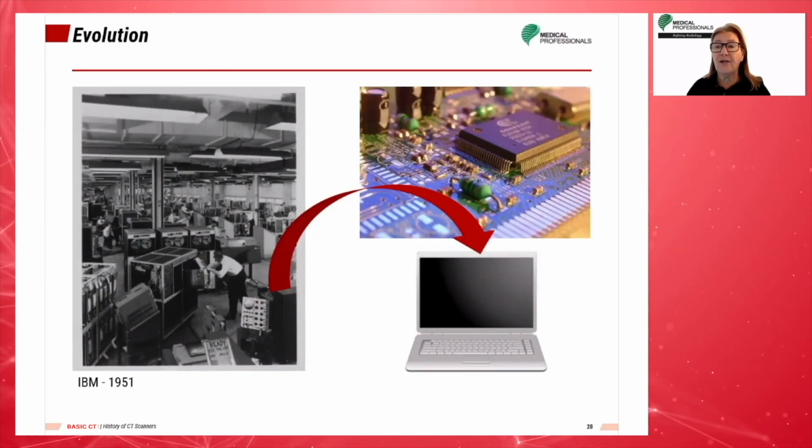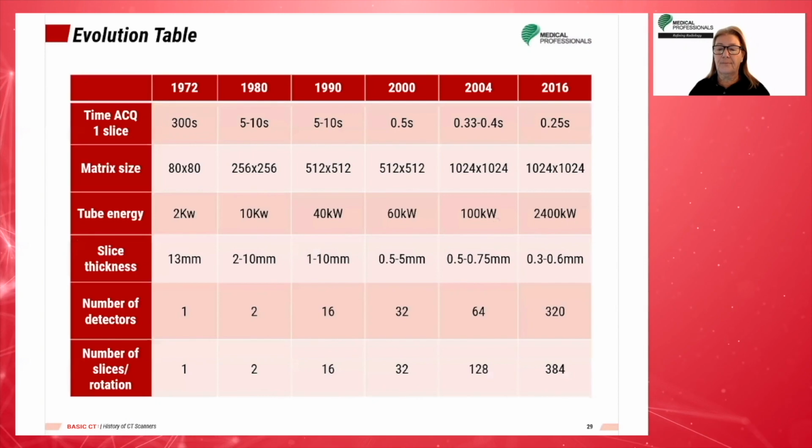This slide shows the evolution of CT imaging over the years. When we look at this table, we see the evolution and comparison of CT advancements over the years as described in the explanations of the generations of CT scanners.